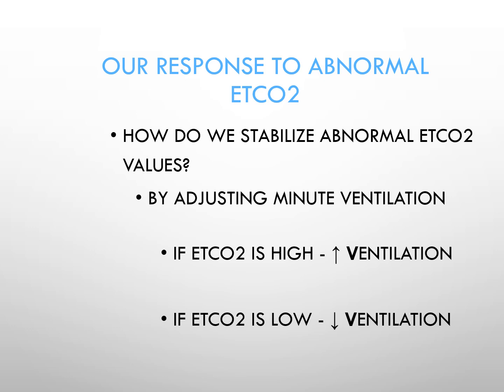However, what often happens is the clinician scratches their head and says, well, if the patient's on mechanical ventilation, do I increase the respiratory rate? Do I increase the tidal volume? The purpose of the next slide is to really talk about that specific issue.